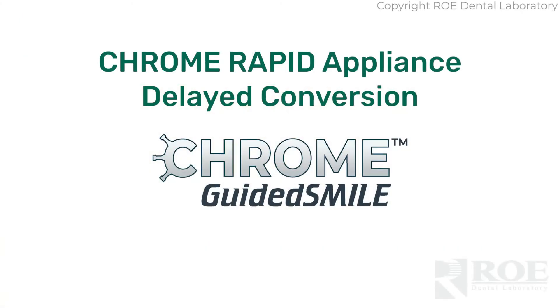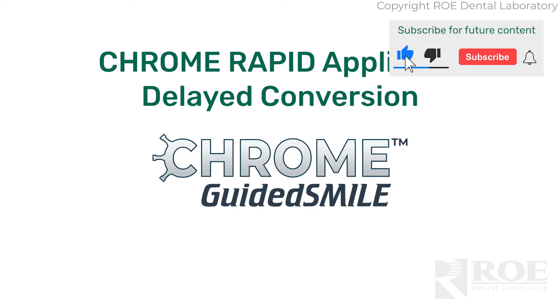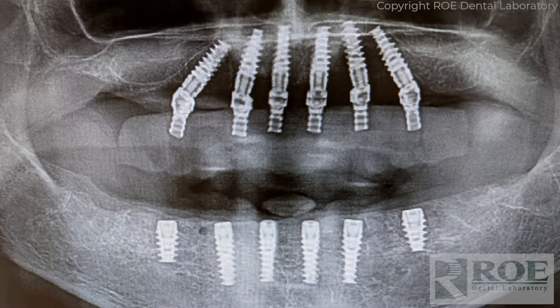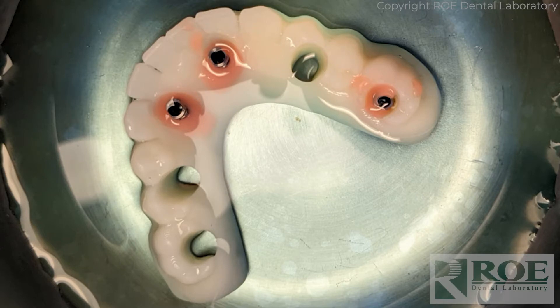This video shows the process of taking a rapid appliance that was partially indexed on the day of surgery. This is a double arch chrome case completed about six months ago. The upper was converted but on the lower there were torque issues on three implants. As we recommend in all chrome cases, if you don't have torque to deliver that day, at least index the implants that were torqued so you don't have to float the prosthetic in later.